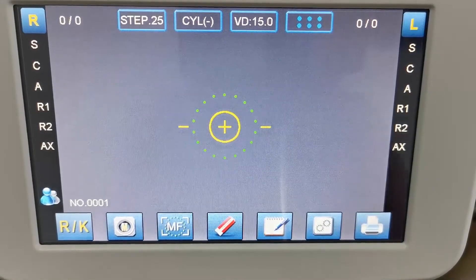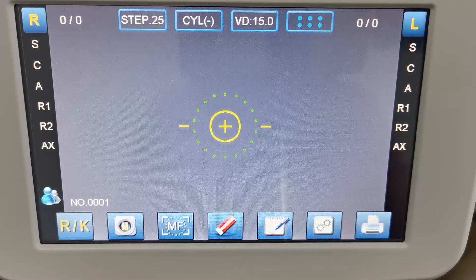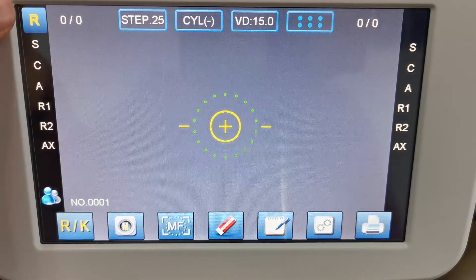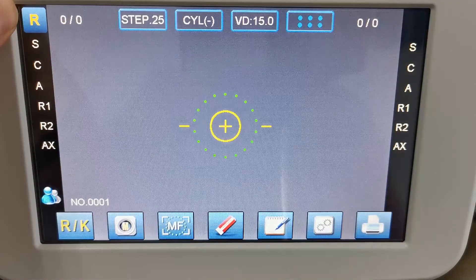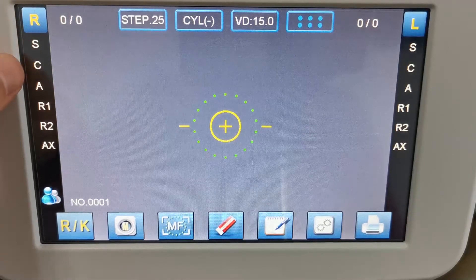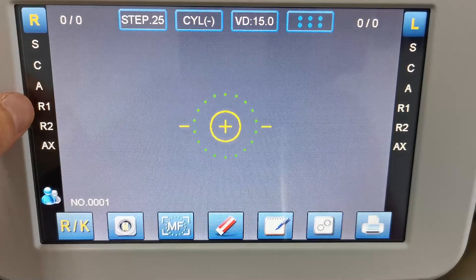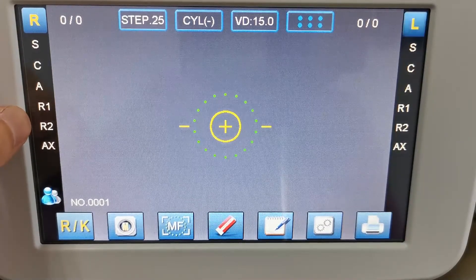First let's check the main capturing interface. Here is the right eye refraction data, the spherical cylinder axis and keratometer parameters.